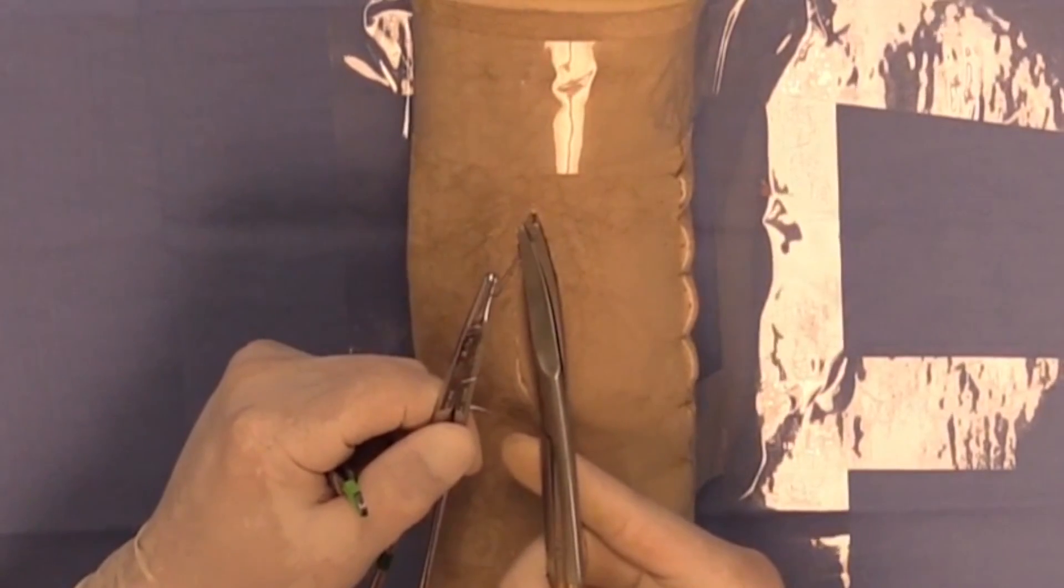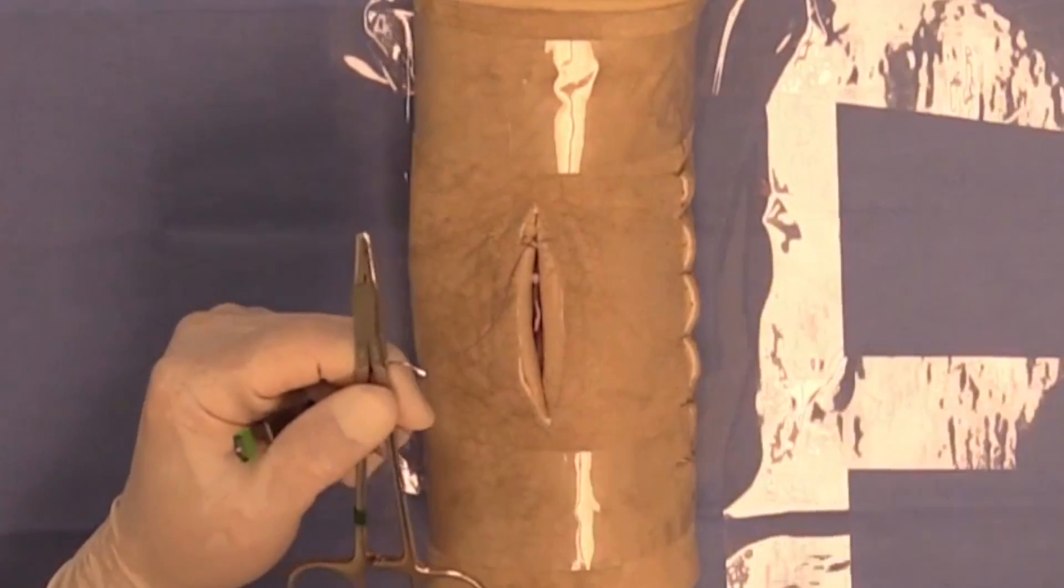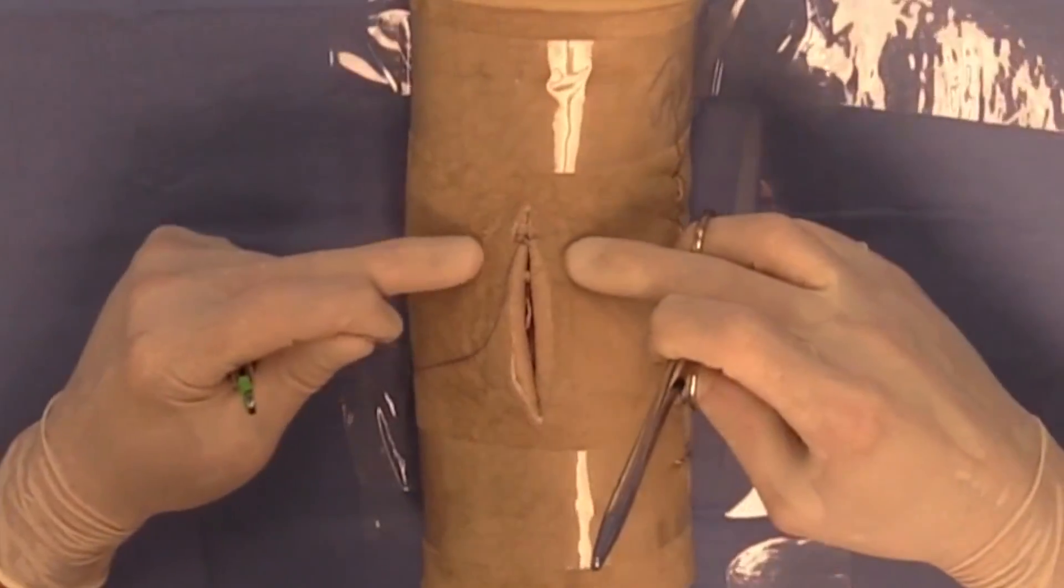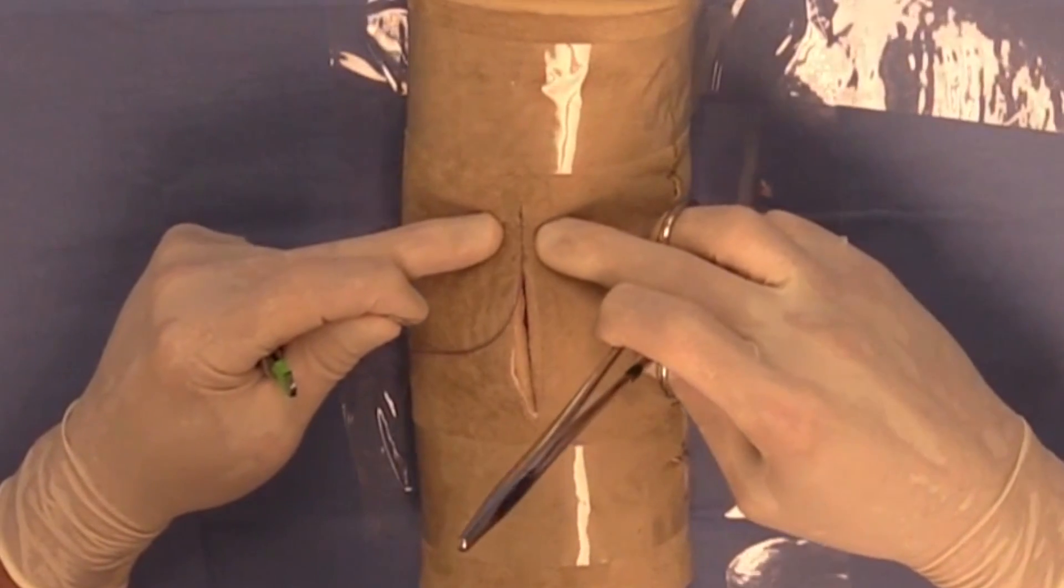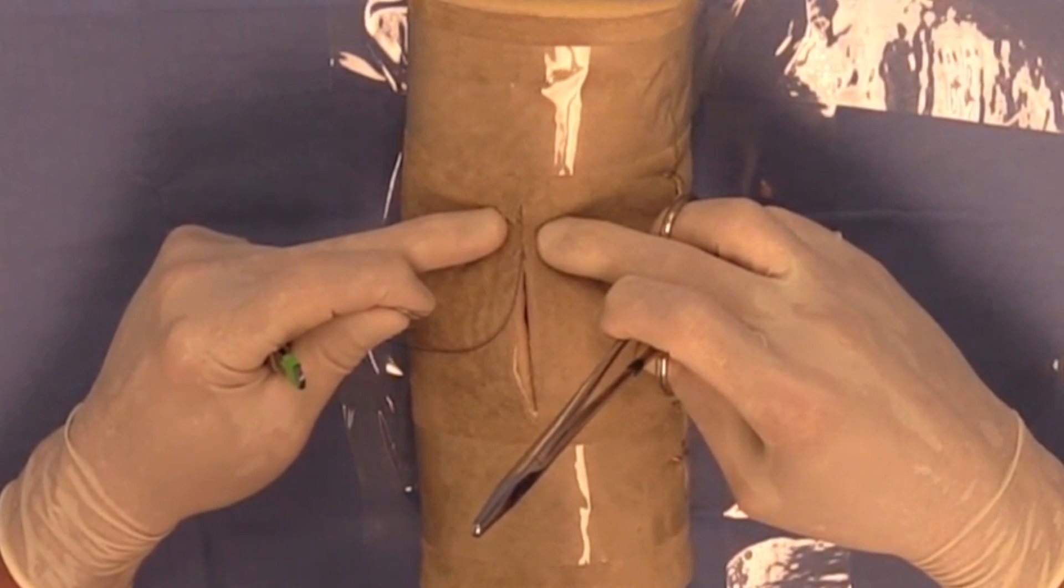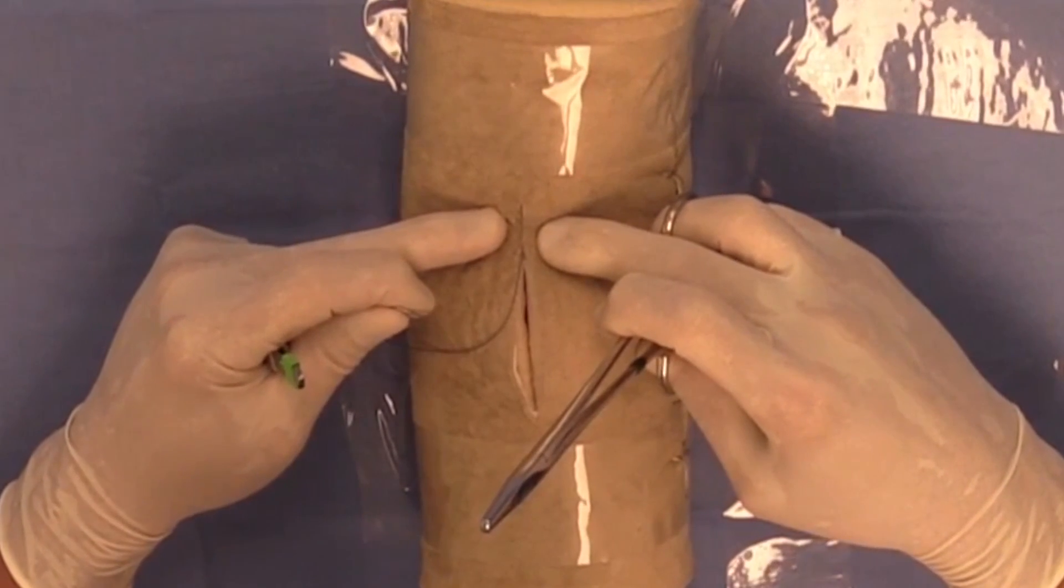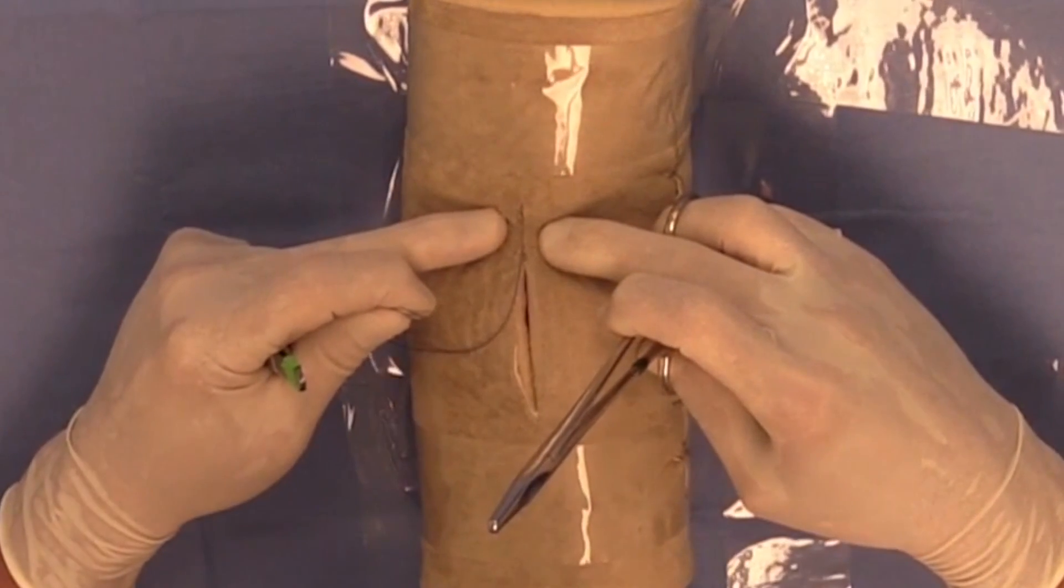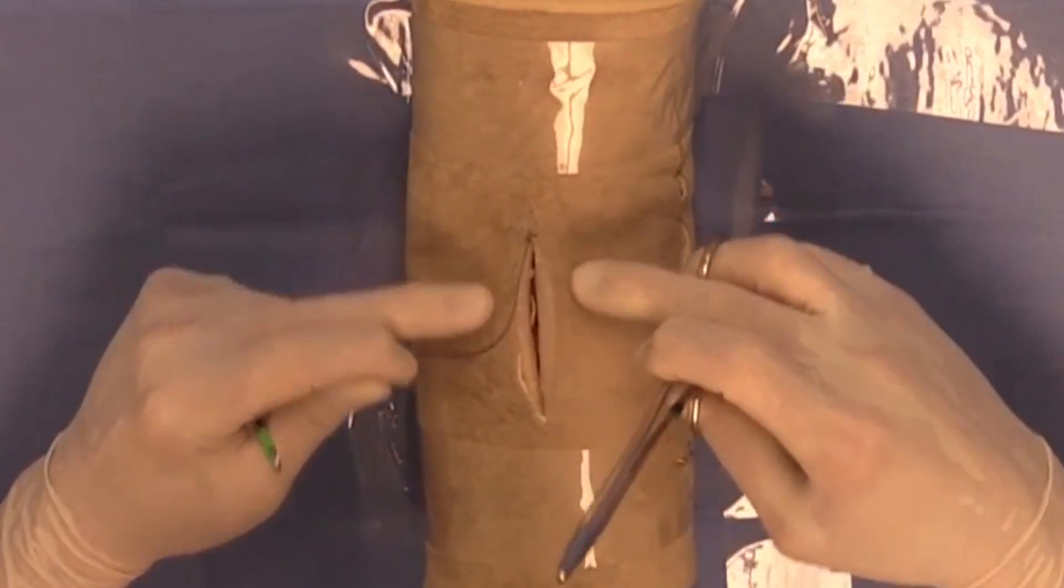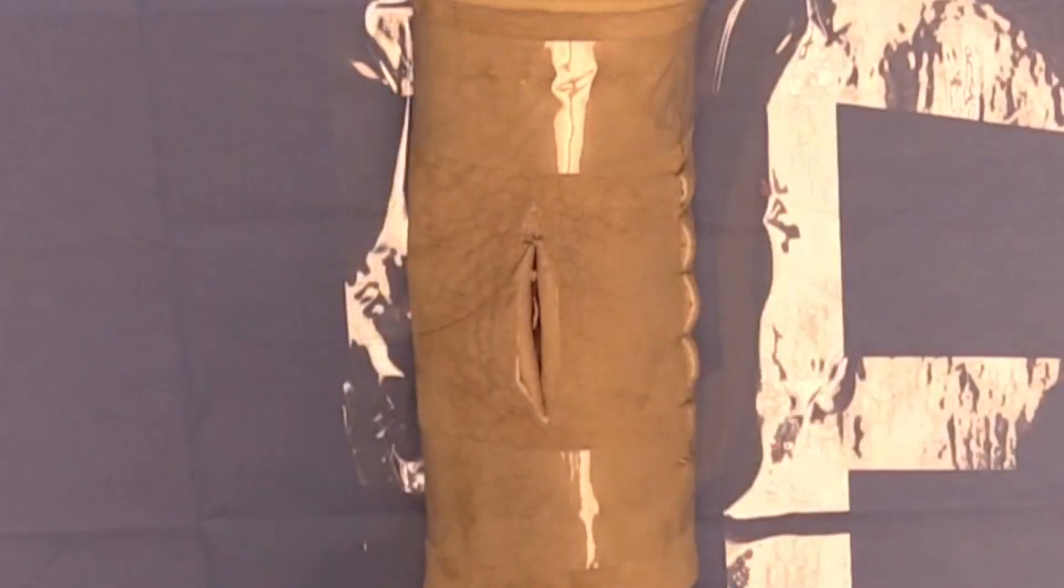One of the things is that you're going to come back and do a skin suture pattern superficial to this and you want to make sure that when you do that you properly bury the knot by suturing the skin over the top of your subcutaneous suture pattern. If you are worried about that then you can begin this pattern by burying the knot as we've demonstrated in another video segment.